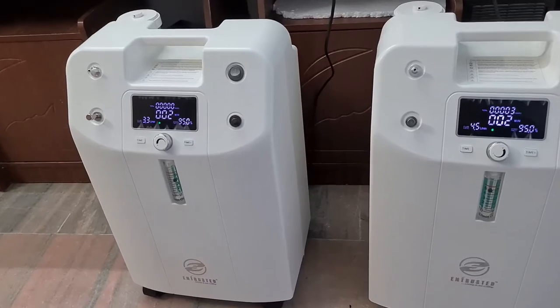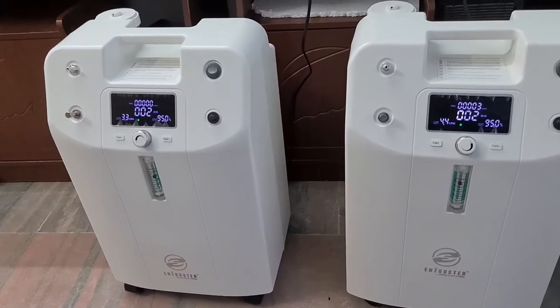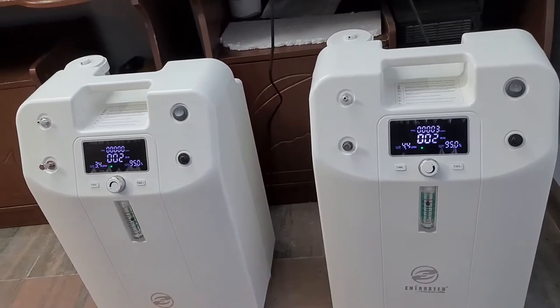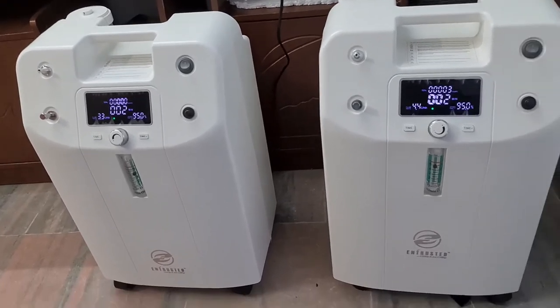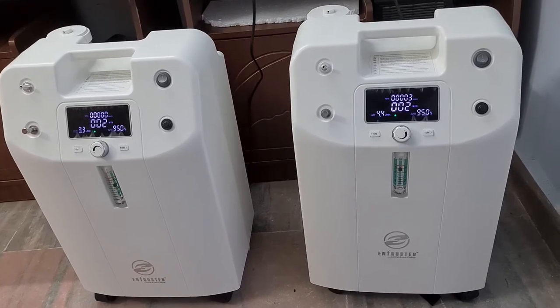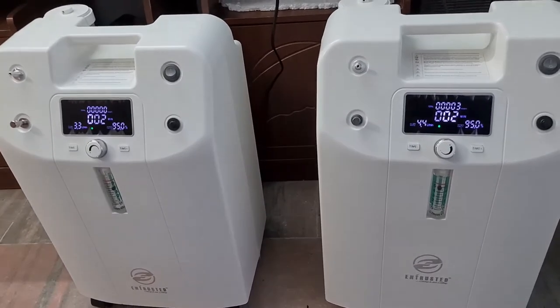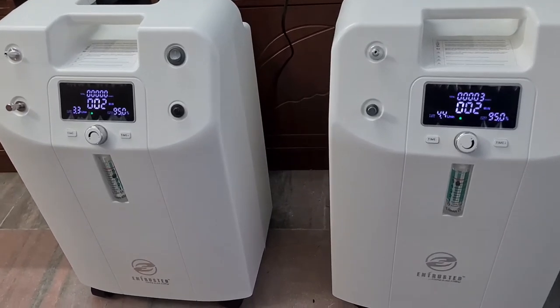A second disadvantage of a standalone 10 LPM machine is that it will not have additional features — it will not come with a built-in nebulizer. Thirdly, the power consumption will be very high. Each 5-liter machine consumes 350 to 400 watts depending on the model, whereas a single 10-liter equipment consumes more than 550 to 600 watts. Even if you keep the flow rate at 2 or 3 in the future, the 10-liter will still consume heavy wattage.